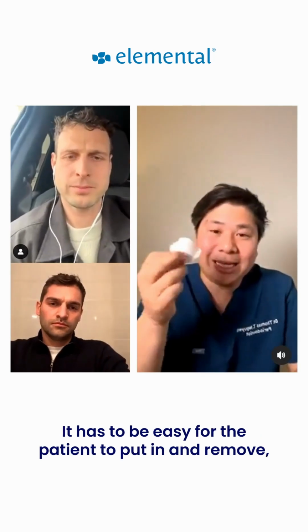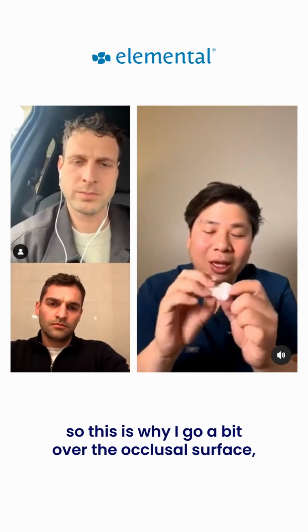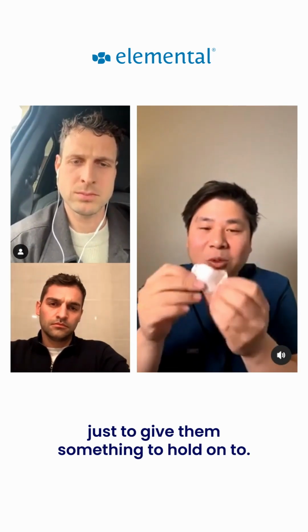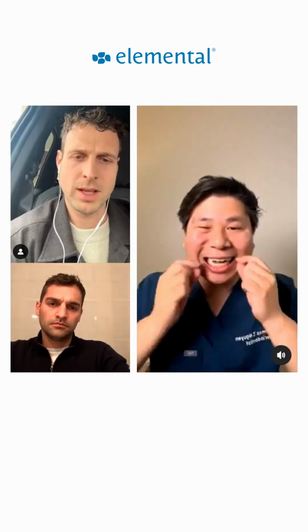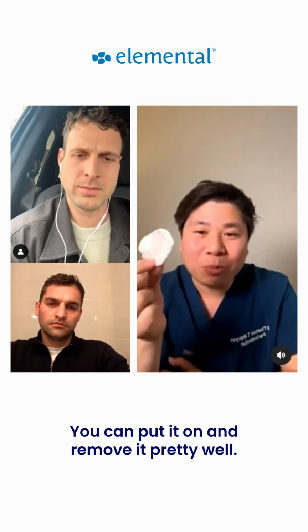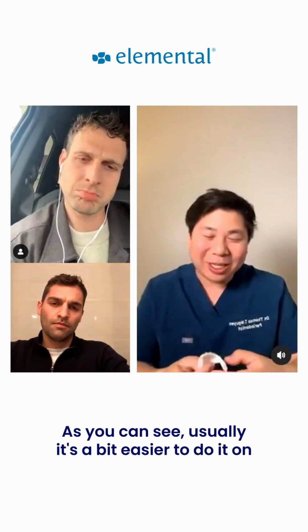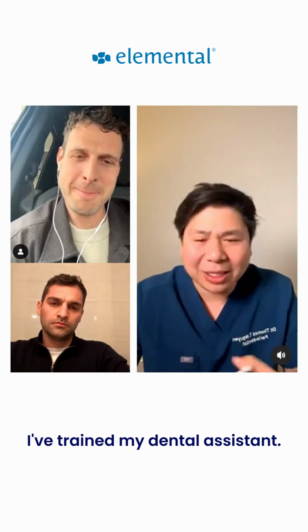It has to be easy for the patient to put in and remove. So this is why I go a bit over the occlusal surface just to give them something to hold on to. Look at that. And you can put it on and remove it pretty well. As you can see, usually it's a bit easier to do it on a patient than on myself. I've trained my dental assistant.